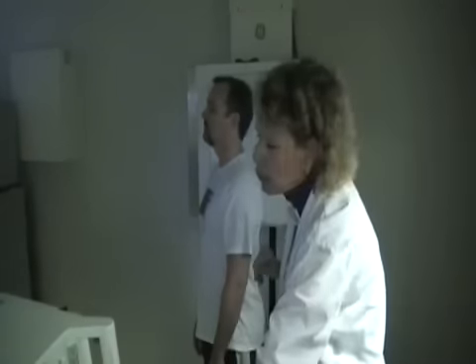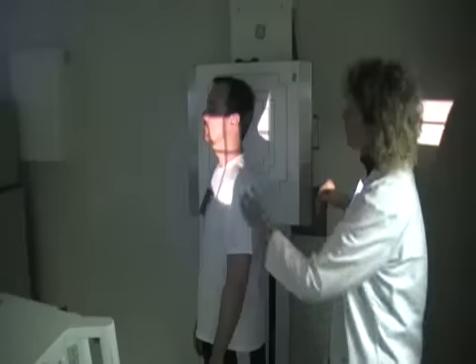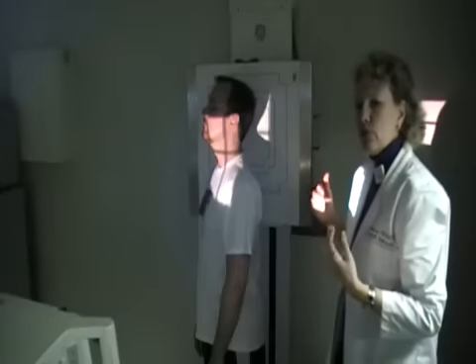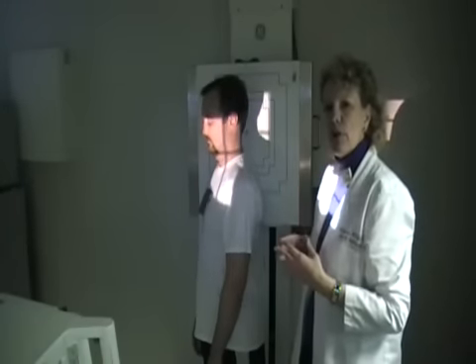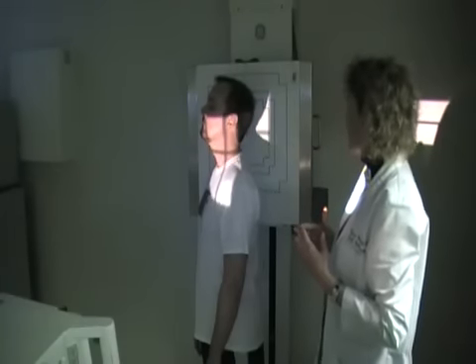Something you want to double check when you're doing these AP obliques is check the chin. You want the chin slightly up. And the reason for this is you do not want the portion of the chin to overlie the upper part of the neck. So bring that chin up just a little bit, and that will take care of that.